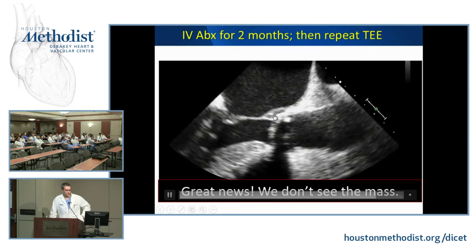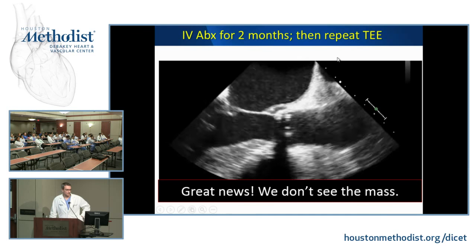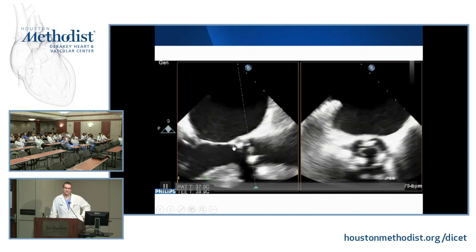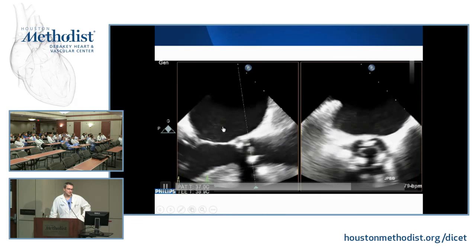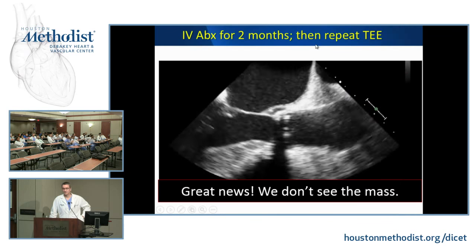So the intervalvular fibrosa that I was showing you here. Now we have this new kind of lucency here we didn't see before. I'll take you back. Look at it here. And in retrospect, when you look back, maybe it was there. It is maybe an early call, I'm not sure, but this is what happens. And sometimes when you're not sure, you repeat studies. And this is why you repeat studies after a time frame of say 2 weeks later.